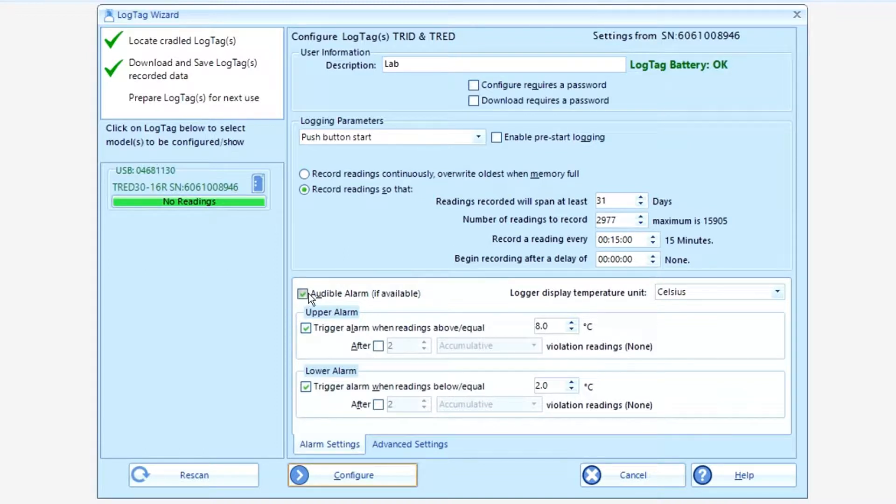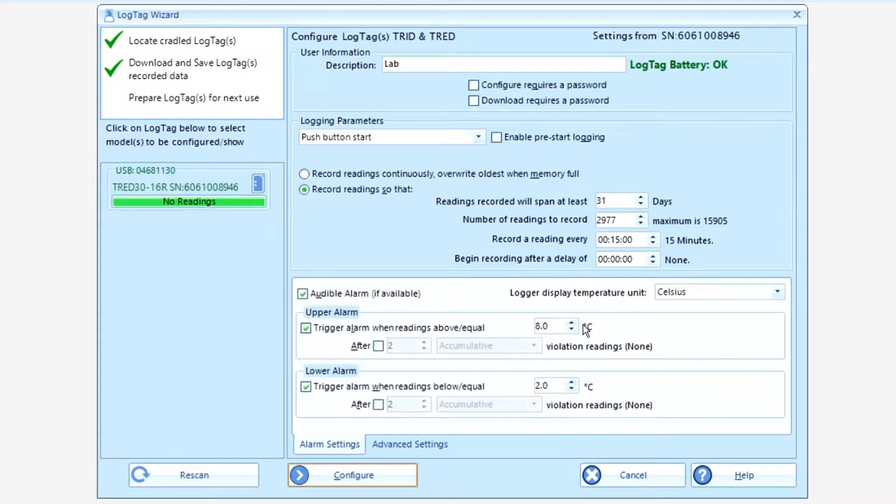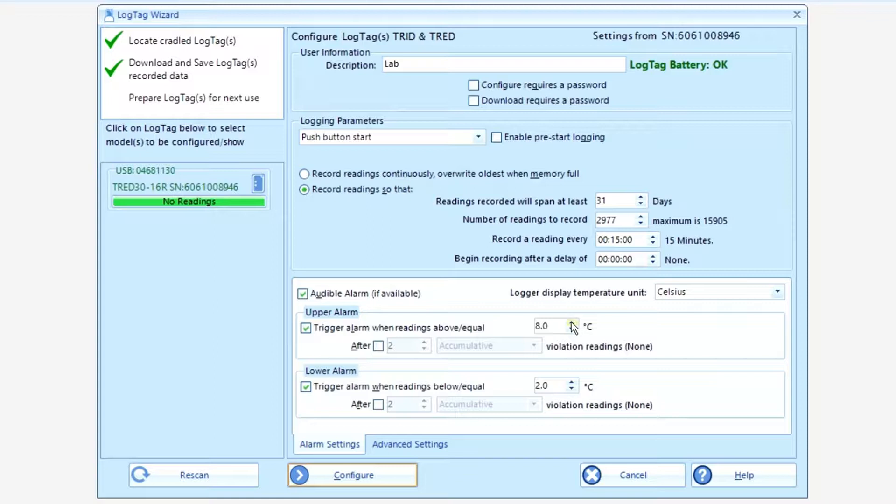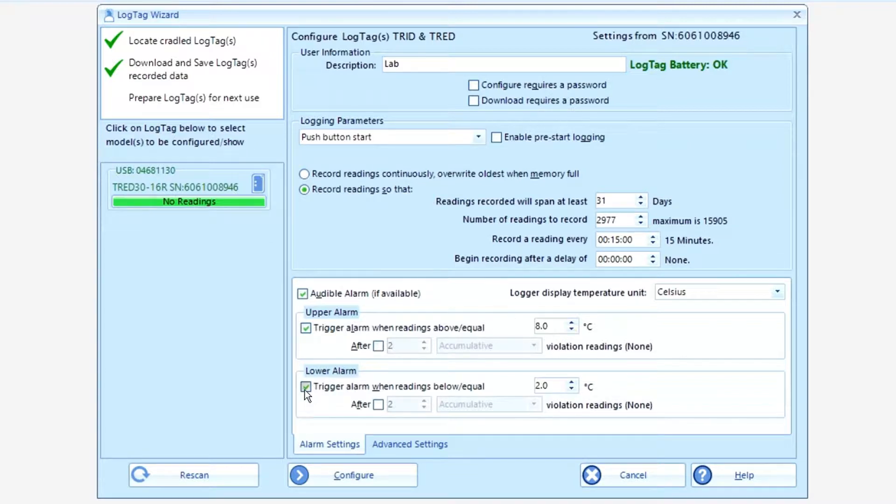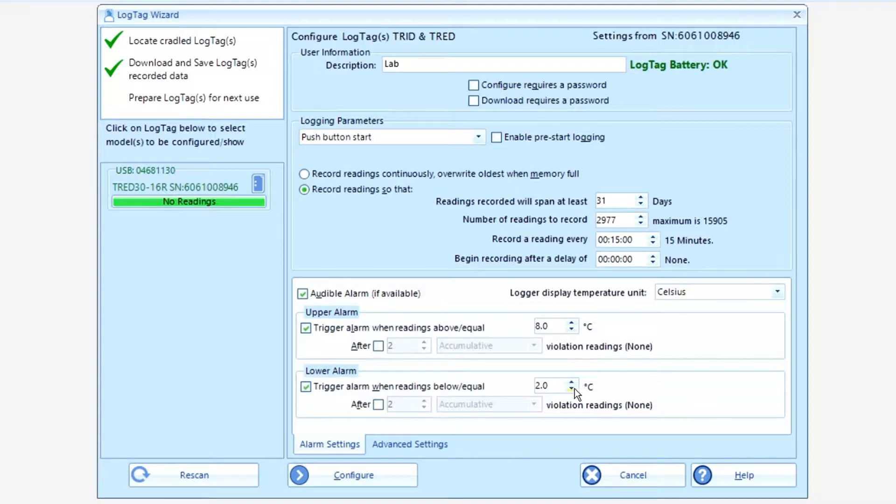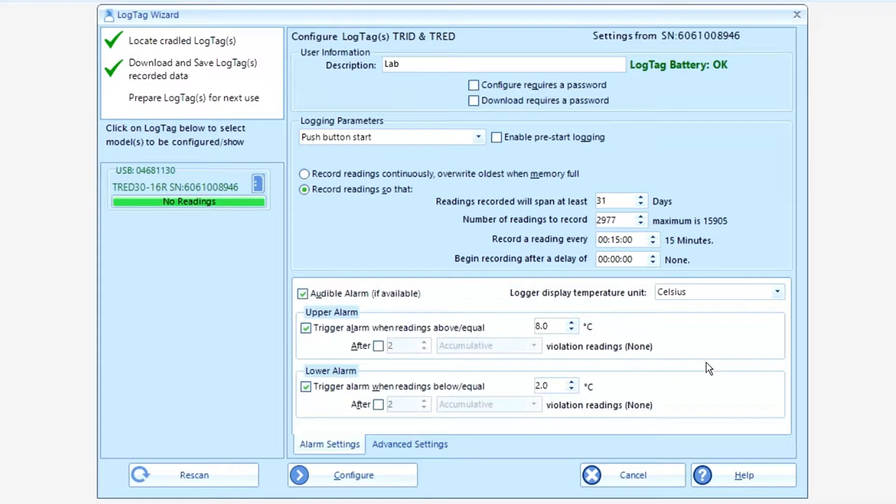In the lower section, you have audible alarm if available. We recommend ticking that. Trigger alarm when reading is above or equal to, in this case we have it set to eight degrees. That's the default for refrigerated vaccines. You can change the values by just ticking up or ticking down to whatever values you want. And the same for the lower. We'd also recommend having trigger alarm when readings are below or equal to. In this case, for vaccines, it's two degrees for most states. And that's your alarm triggering set points.